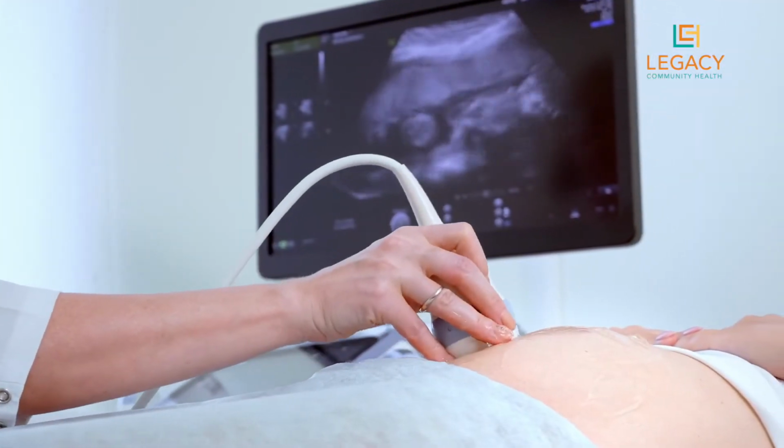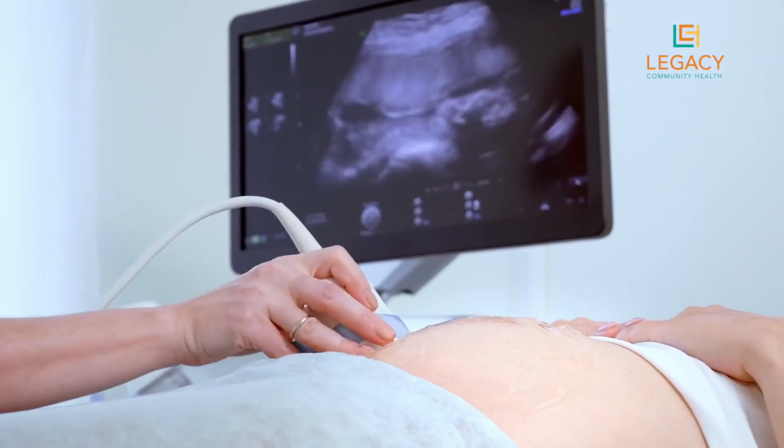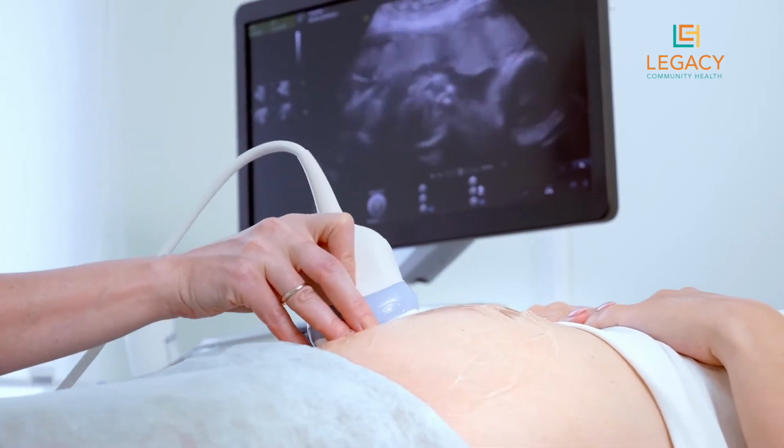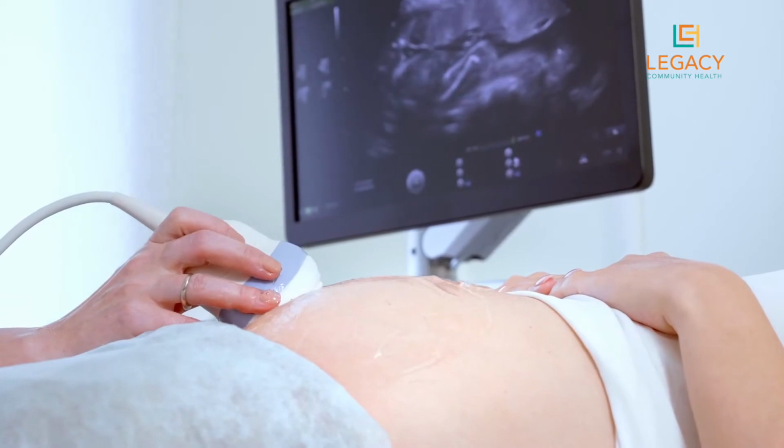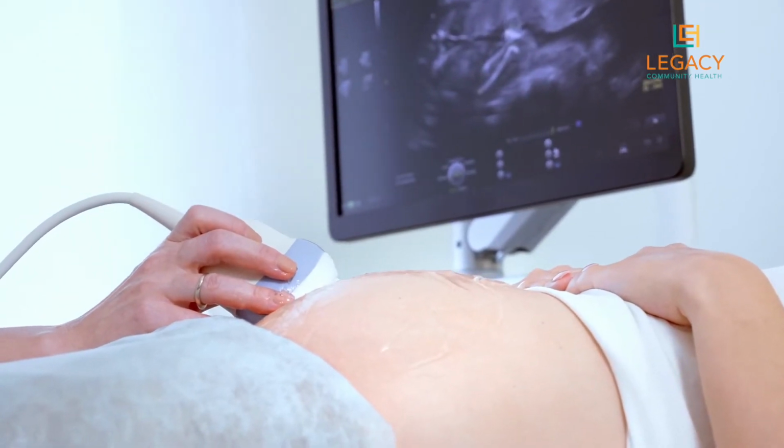I'm glad you asked that. Ultrasound is energy in the form of sound waves. During an ultrasound exam, a transducer sends sound waves through the body. Those sound waves come into contact with tissues, body fluids, and bone. They bounce off and are sent back like echoes towards the transducer. The transducer then receives these echoes, which are turned into images, and those images can then be viewed as pictures on a video monitor.